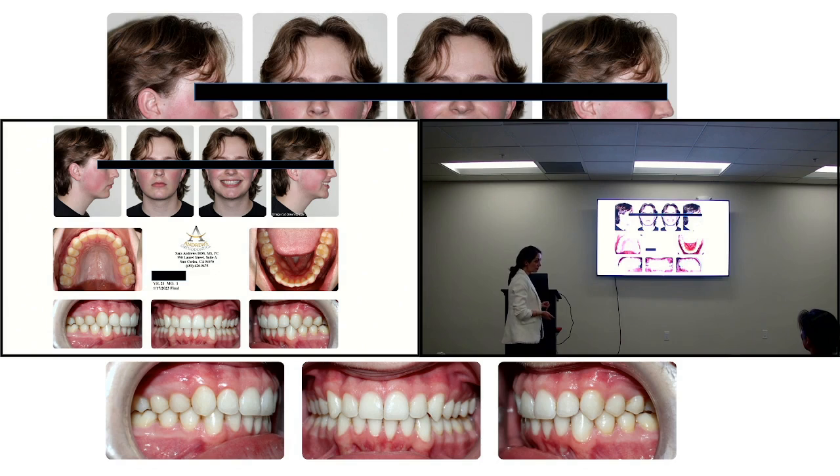Some people have a really narrow anterior mandible. So you anticipate that, and based on that, you add a lingual torque. There you go. You already know that. Exactly. Some people just have a very thin biotype, we call it, very thin attachment. If they are super prominent, and if they are rotating and retracting, you want to add lingual torque to the root, so that it doesn't look that prominent. Exactly. See, this is stuff that no instructor taught me. I just learned it on my own.